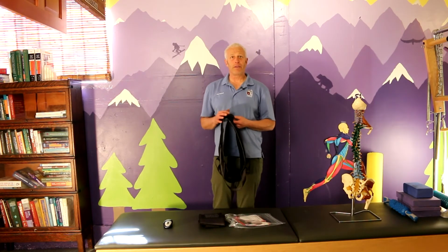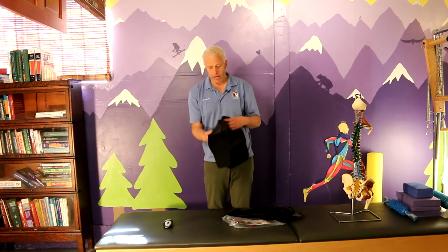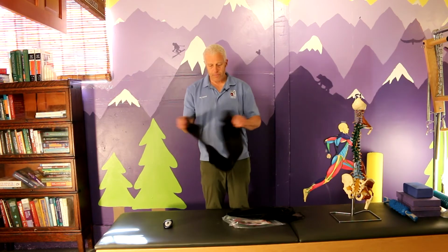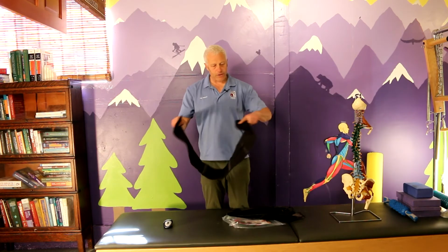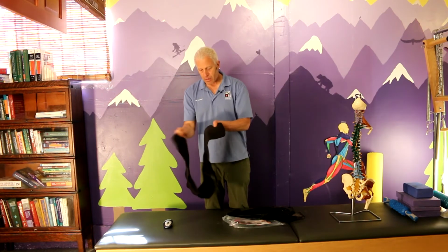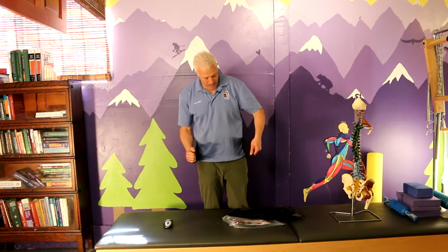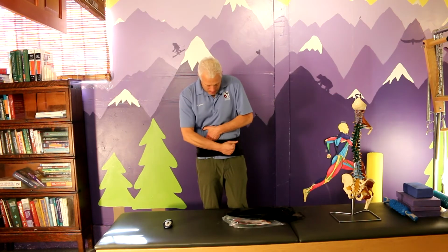Here's the other one, the Ace Bandage one. What you have here is the strap, and it's going to go on like that. So let me put it on, and tighten it. And then I have these additional tighteners like that. It certainly makes things more stable, but it's a step below the Core Fit one.